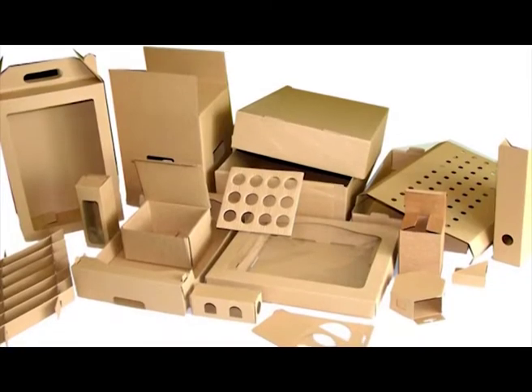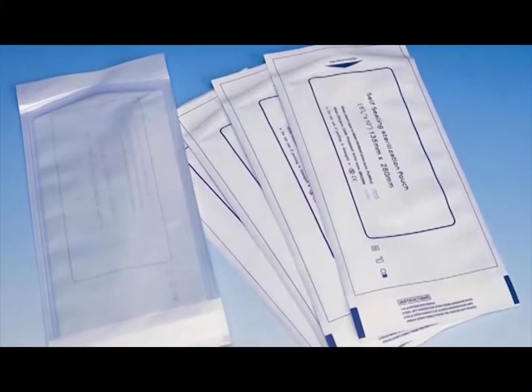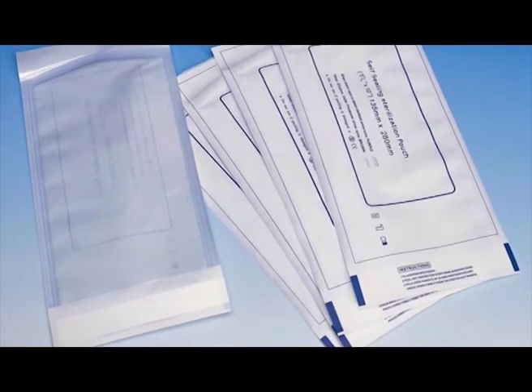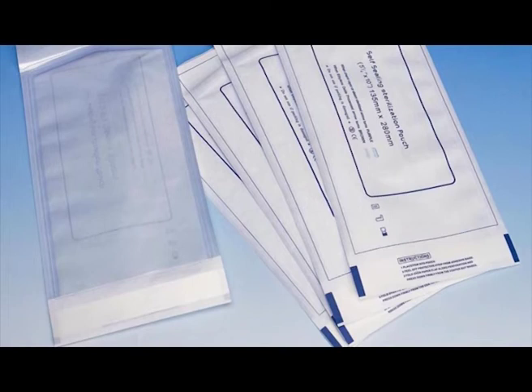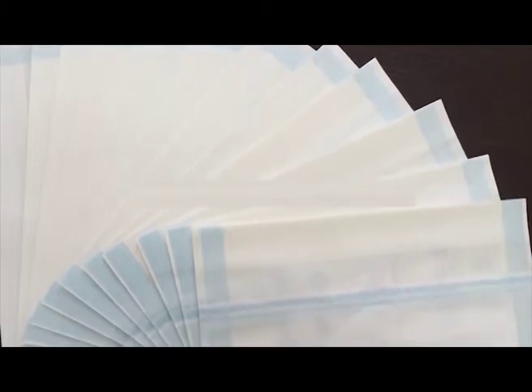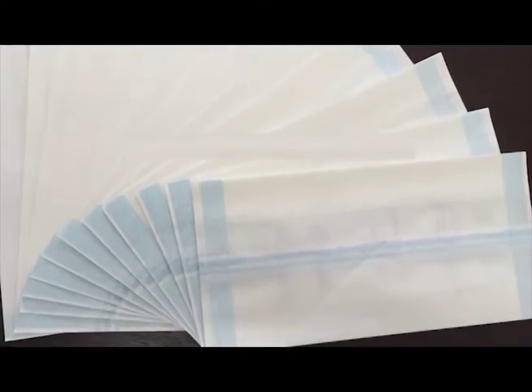Paper is the material most commonly used for packaging in hospitals. It is used in pouches and bags, disposable packaging sheets, and in cartons. The paper used in pouches must let steam and gas pass through during the sterilization process when the paper is damp and the pressure in the autoclave is high. In dry conditions, however, the pores must be closed to keep air and microorganisms out. This very special porosity is a unique requisite for sterile packaging paper.